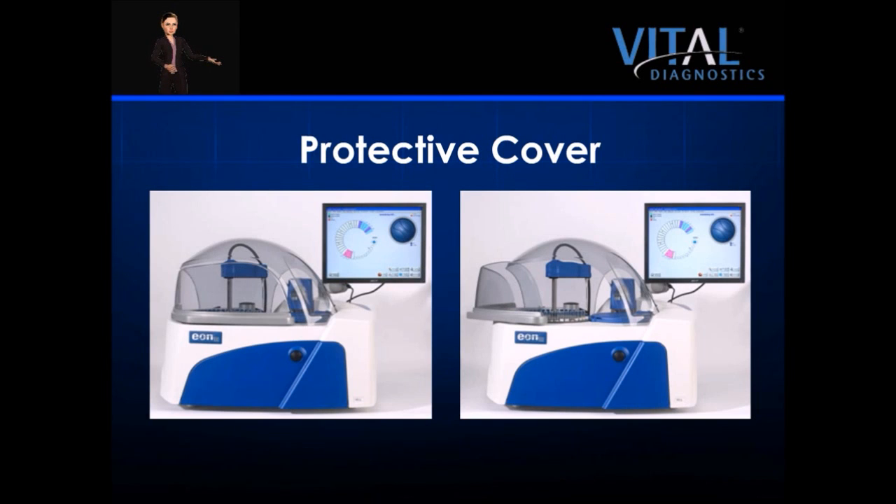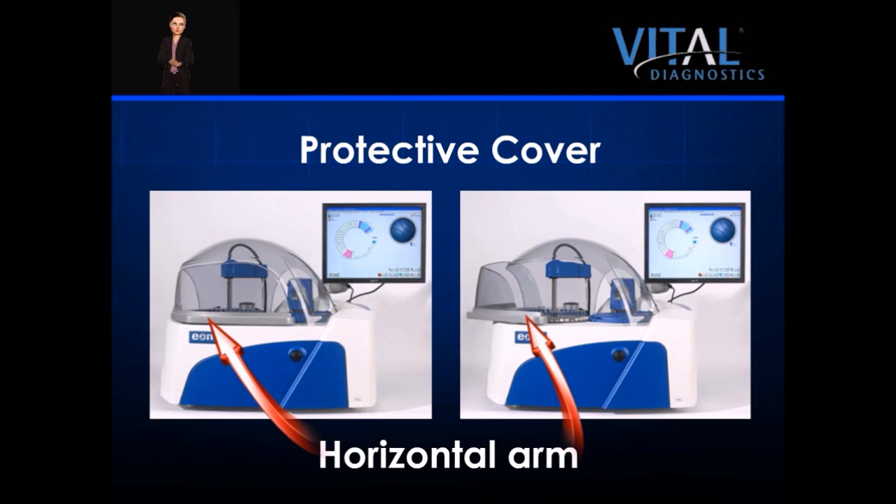The cover on the EON100 is designed for protection and functionality. It features a horizontal arm that swings open, allowing the operator easy access for loading and unloading reagents and samples. Opening the cover pauses the instrument without affecting runs in progress. The cover is constructed of a light, tinted plastic to reduce light exposure to sensitive reagents, and is designed to create an effective chamber to reduce reagent evaporation.